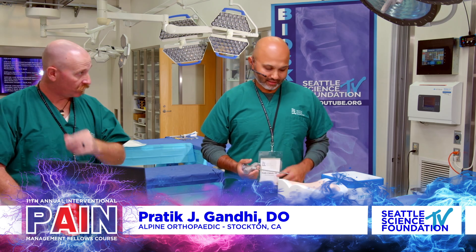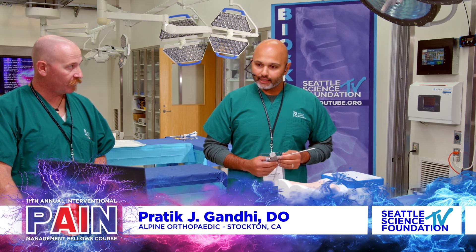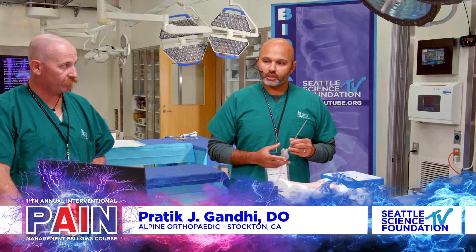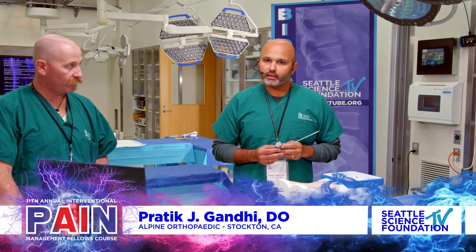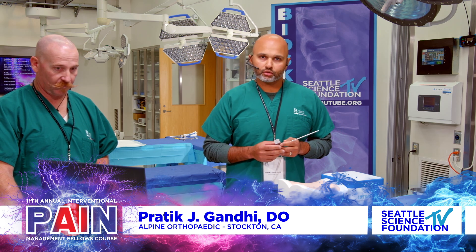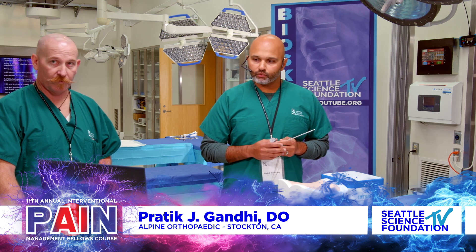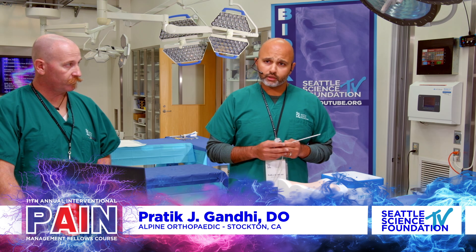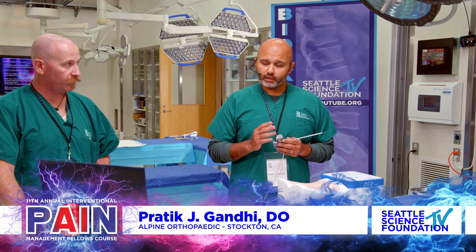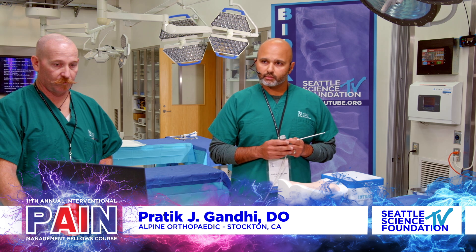We don't have to deal with cold cadavers or warming them up and hammering into hard bone. The key to this procedure is really getting your anatomy upright and straightforward going into it. We're going to do an L4 BVN ablation here. The first thing we want to do is make sure our end plate, especially our superior end plate, is sharp. We'll add some caudal-cranial tilt and make sure it's sharp.